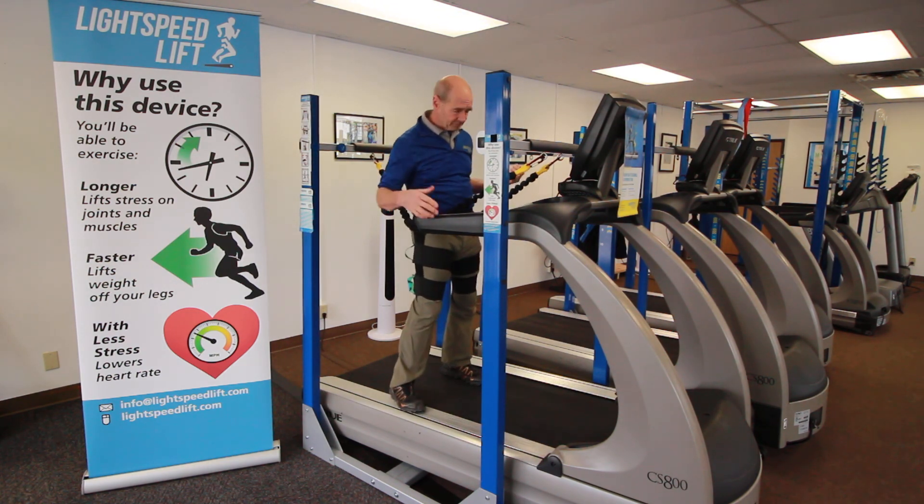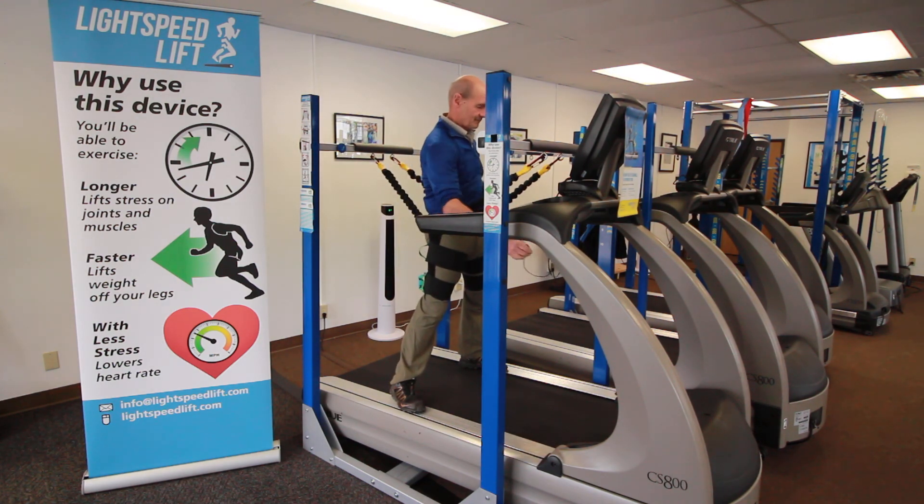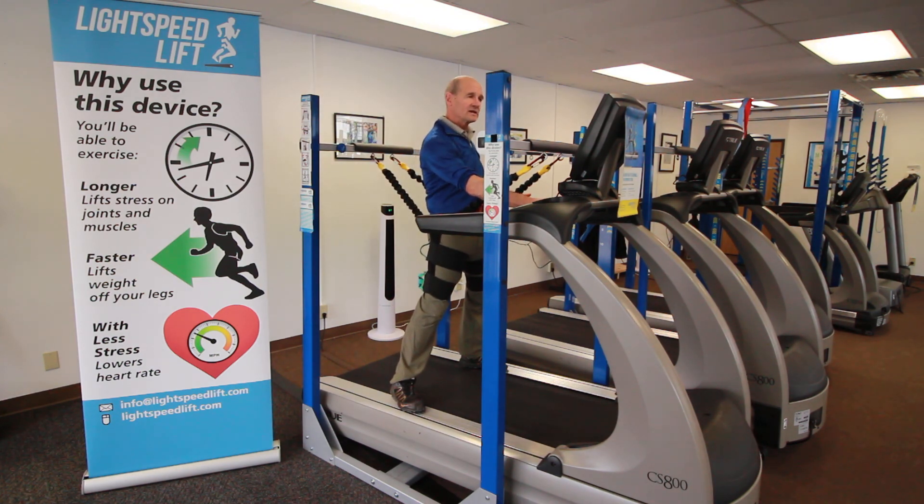Now I'm ready. Like any normal treadmill, straddle the belt. Put on the safety clip just in case one does fall. Start that belt. Bring it up to a normal walking speed.